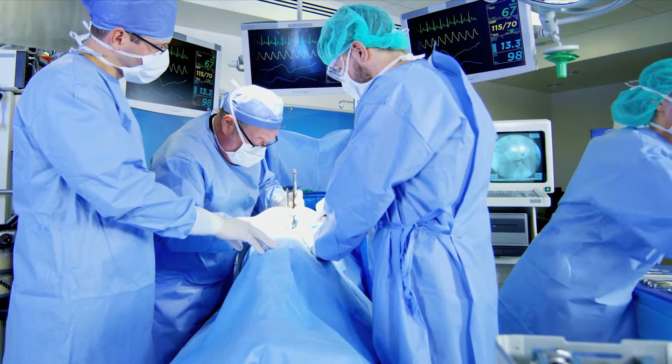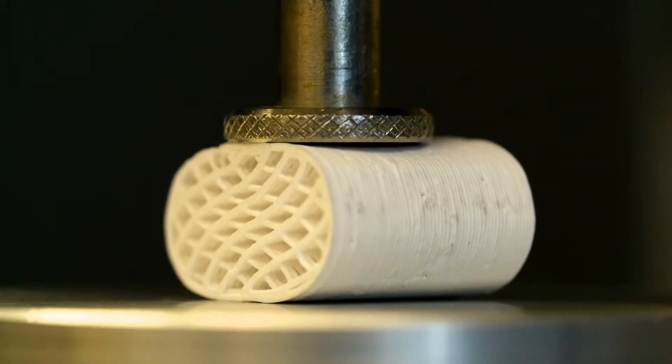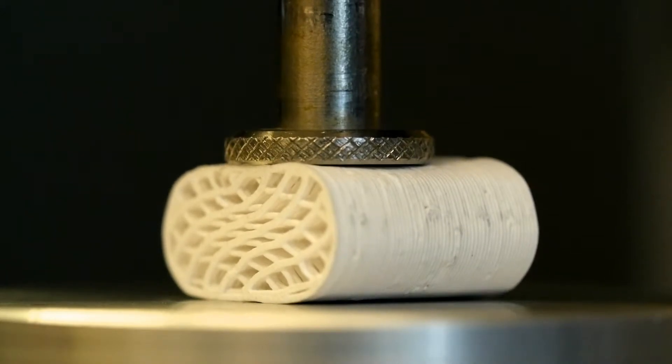Traditional orthopedic products made out of these ceramic-like materials are very brittle. Compared to those, our product has very elastic properties — meaning if you squish it, it bounces back to its original shape.